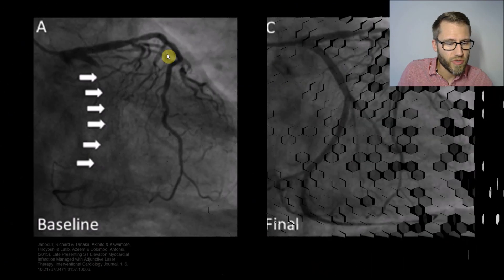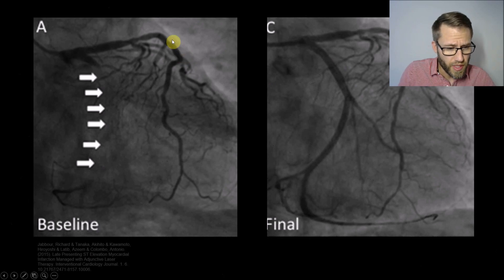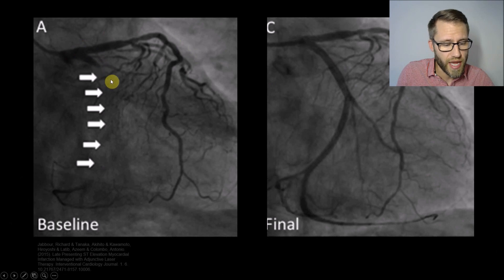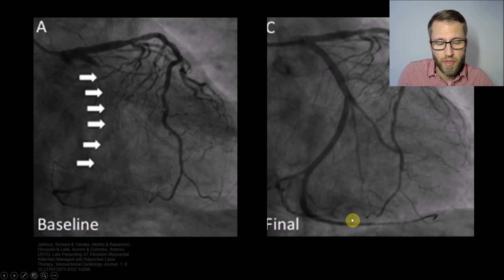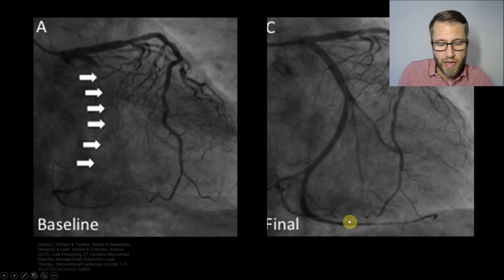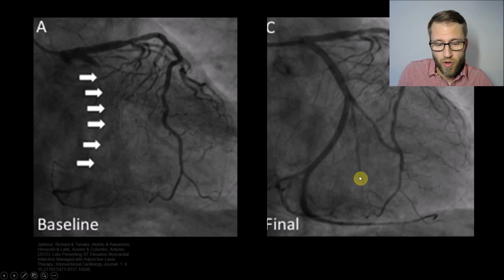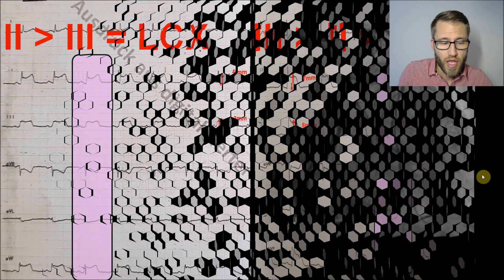If you look at the coronary angiogram in this case, you would find a proximal occlusion of the LCX. You can see some distal parts retrogradely with retrograde flow. After revascularizing this LCX, you see what a large vessel this is — with the left PDA supplying the inferior part of the left ventricle and the posterolateral part covered by these obtuse marginal branches.